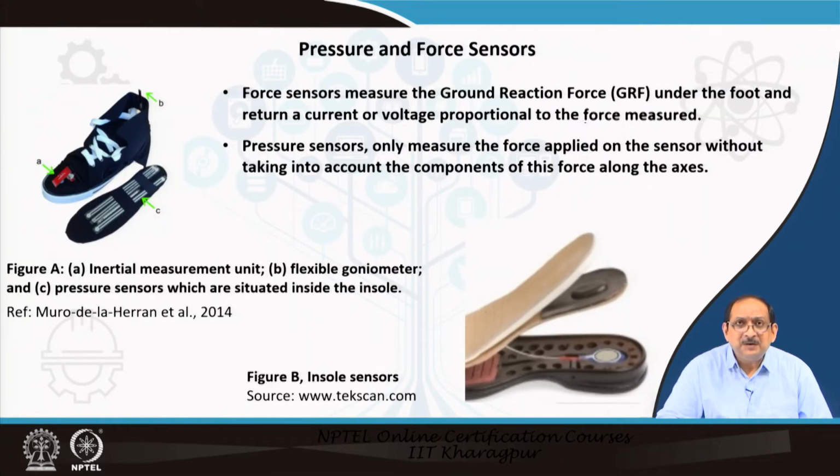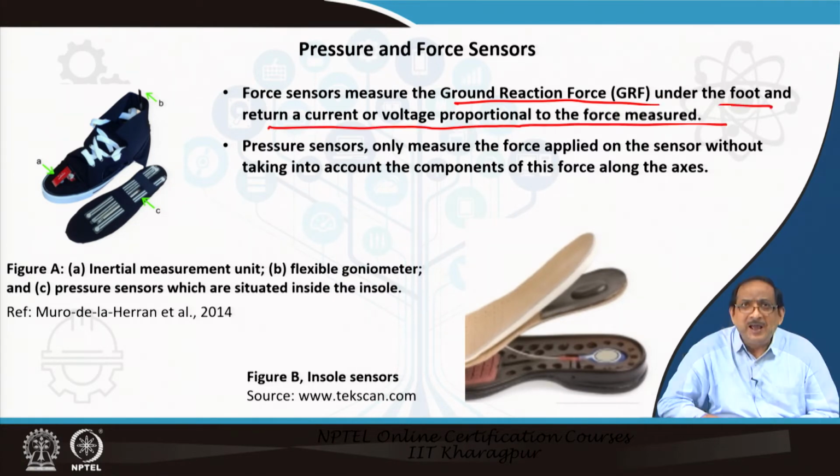Now, pressure and force sensors are wearable sensors, and the force sensor measures ground reaction force under the foot and returns a current or voltage proportional to the force measured.